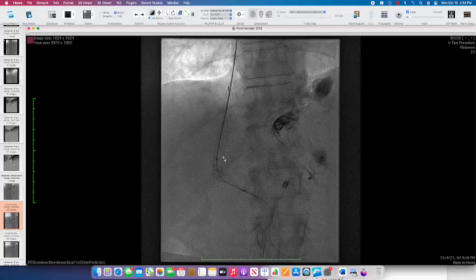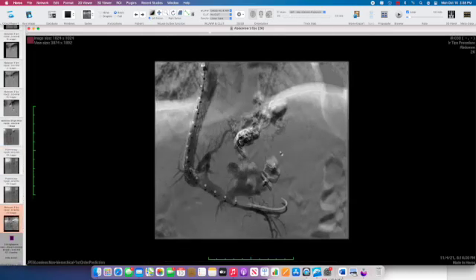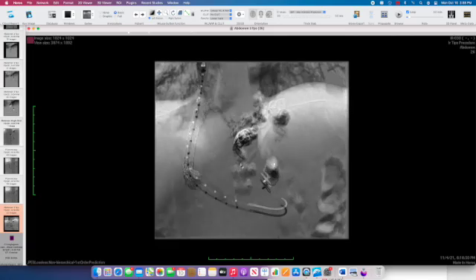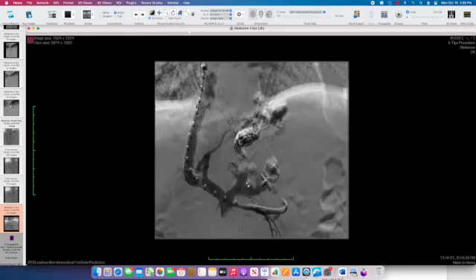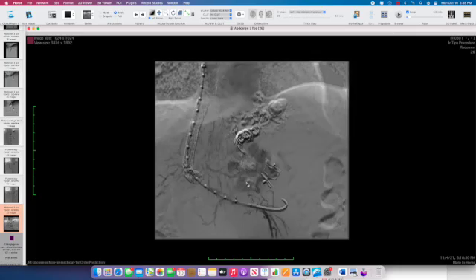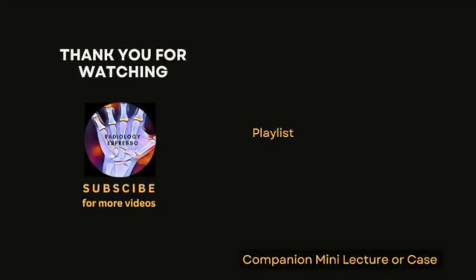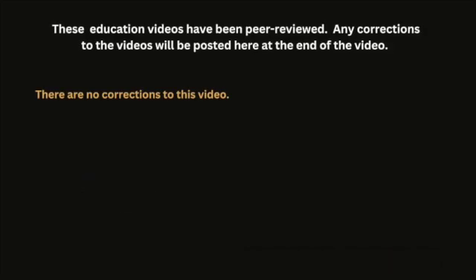We used some contrast, air, and sclerosant to coat those gastric varices so they scar down, with all the medicine staying in place because the outflow was plugged. Once that was done, we finalized our TIPS access by putting the stent into place. On our final picture there's still a little flow towards the varices, but now that there's an outflow path with less resistance, these will ultimately shrink and everything will go towards the TIPS. It was a lot to explain, but it covers portal hypertension and our two biggest therapeutic options — TIPS and BRTO/PARTO — and we happened to do both in the same patient. It was definitely a time-consuming procedure, but ultimately she had a great outcome.